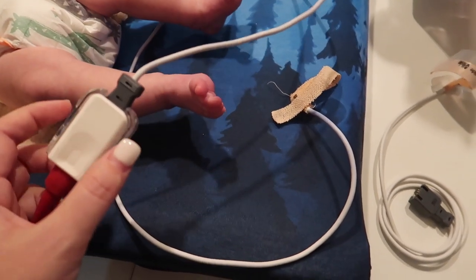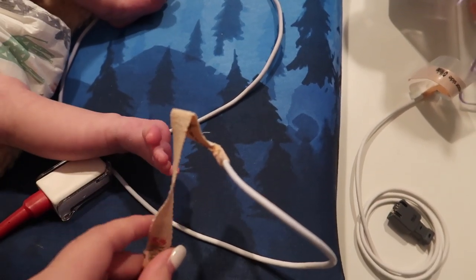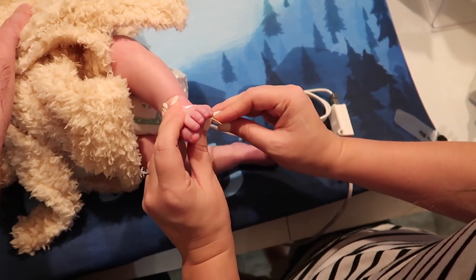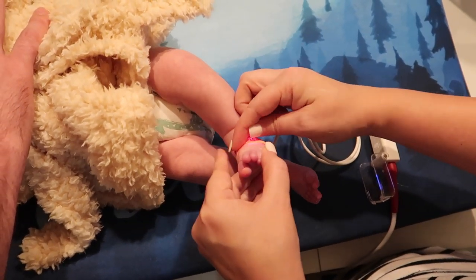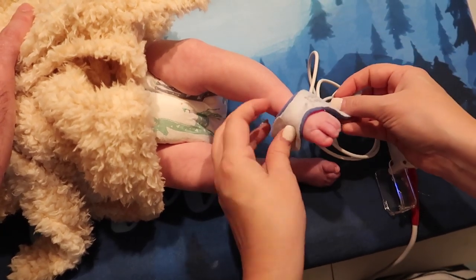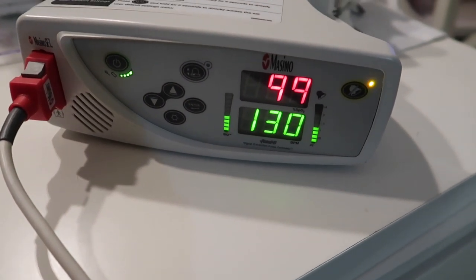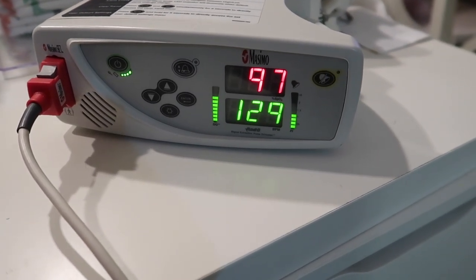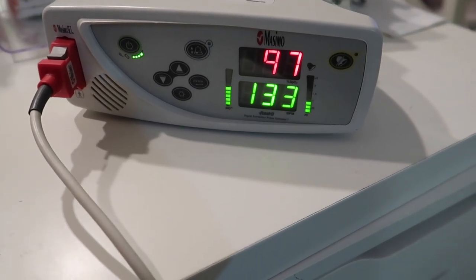I'll show you what it's like to put his pulse ox sensor back on. This is what his old pulse ox sensor looks like — this part you can pull out, and this is the part that wraps around his foot. These little sensors get kind of stinky and wrapped around their foot so tight, and they also stop reading as well, so we're going to switch it. We just got the new sensor on his foot and it takes the machine quite a long time to regulate. It looks like he's satting above 94% even after having his oxygen off for about 30 minutes. He's never been off his pulse ox before — that was the first time ever.